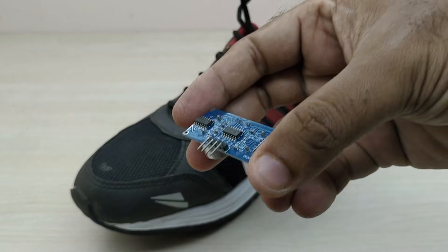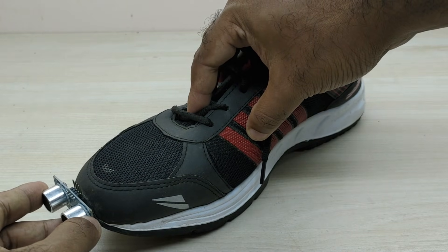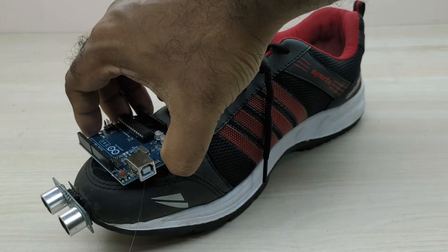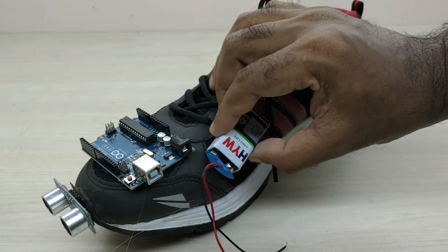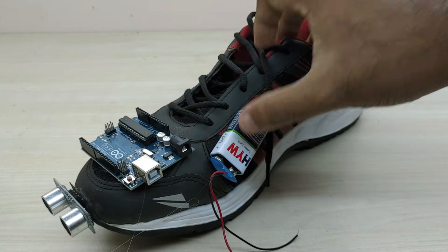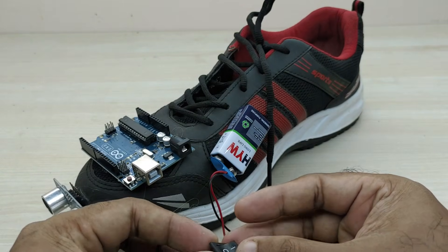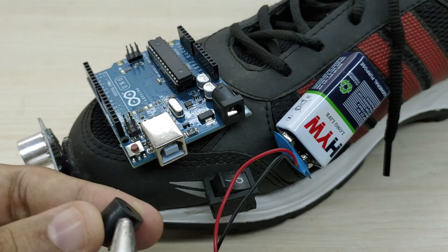First, fix the ultrasonic sensor at the front of the shoe. Then fix the Arduino Uno, 9V battery, and the switch as shown. Fix the buzzer also as shown.